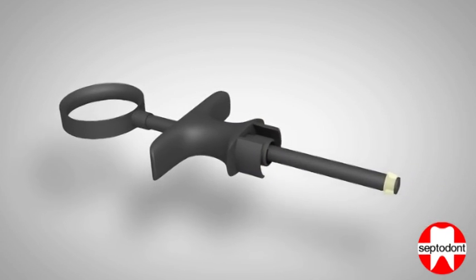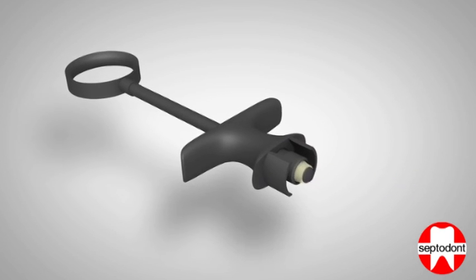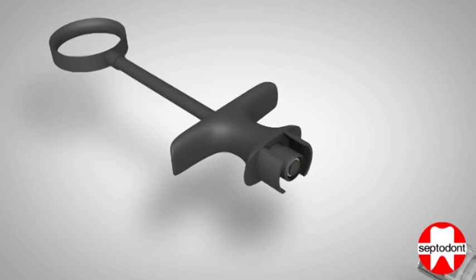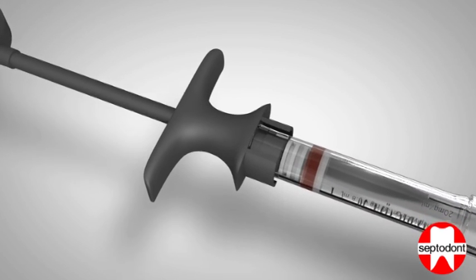Step 2: Slide the finger grip to the end of the plunger, making sure it completely covers the silicon tip. Insert the handle into the open end of the syringe directly behind the cartridge.